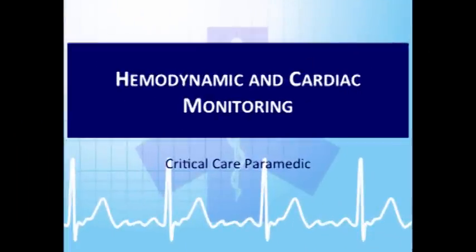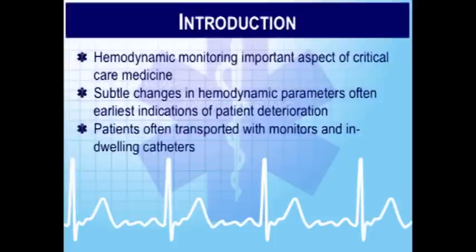So something that is outside of what you definitely do in the field normally, and even outside of what most emergency rooms do, is this concept of invasive hemodynamic monitoring. But if you're transporting critically ill patients, they're going to have these devices in their bodies. In most circumstances in the state of Wisconsin, if you're transporting a critically ill patient, you're going to have an ICU nurse along with you, right?